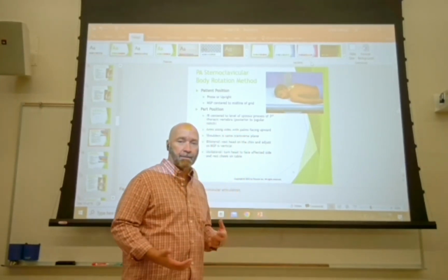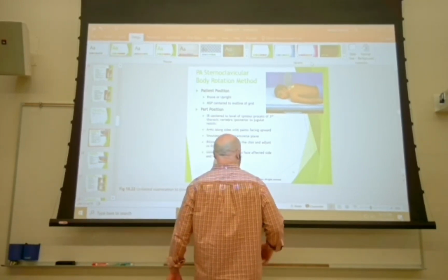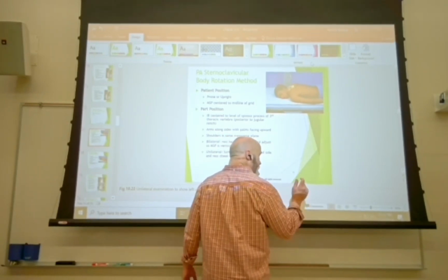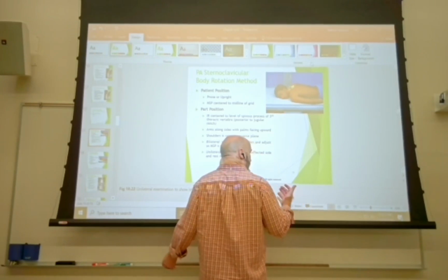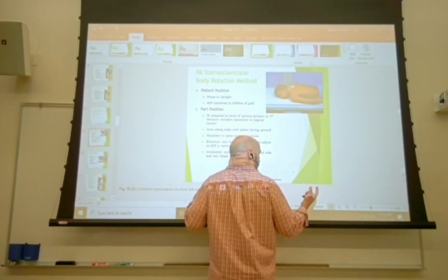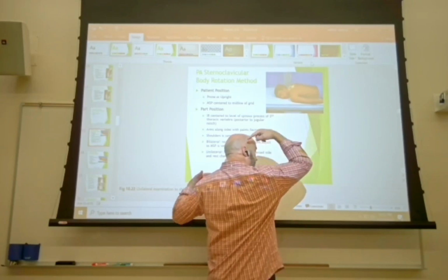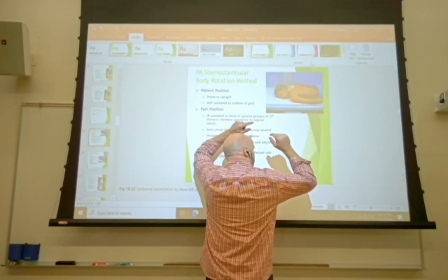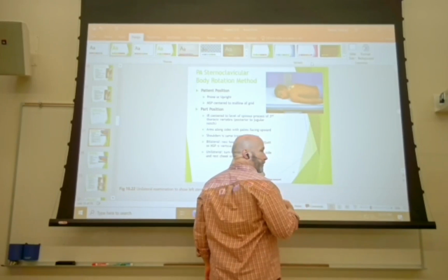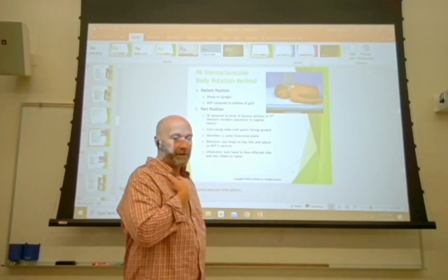Most patients are not going to be flexible enough to turn their head without turning their body just a little bit. So as the patient looks to their right-hand side, their body is going to rotate just a little bit. It's not enough to call it oblique, but it does turn the body slightly. As I look to my right-hand side, my spine is going to go that way, and my sternoclavicular joints are going to go that way just a little bit. So you're going to position the patient prone, have them look to the right, and make your exposure, with your centering right at the jugular notch.